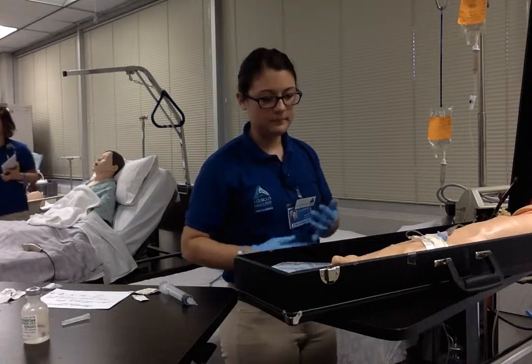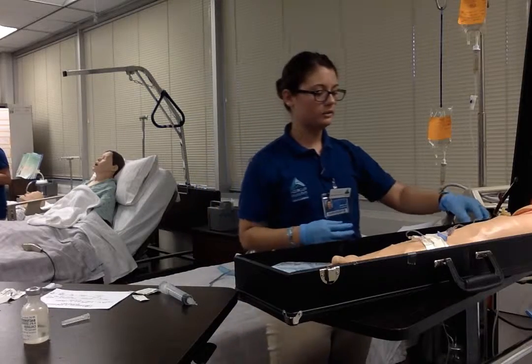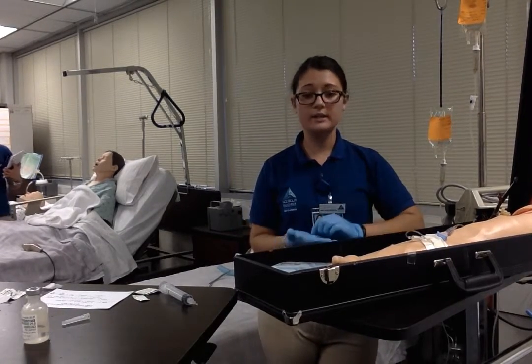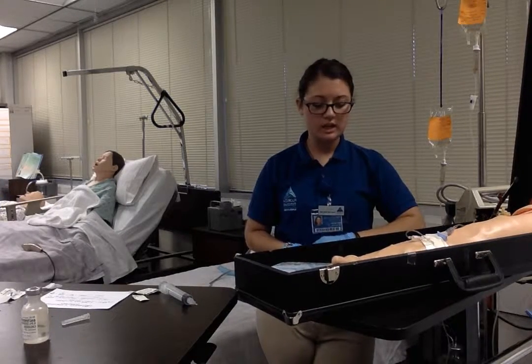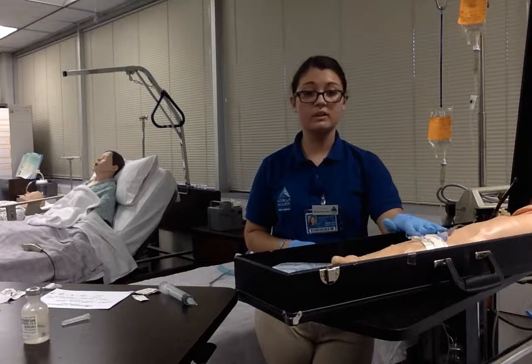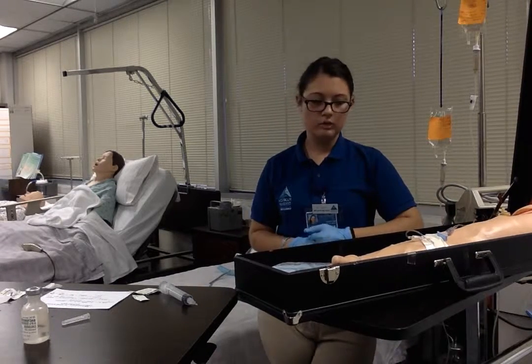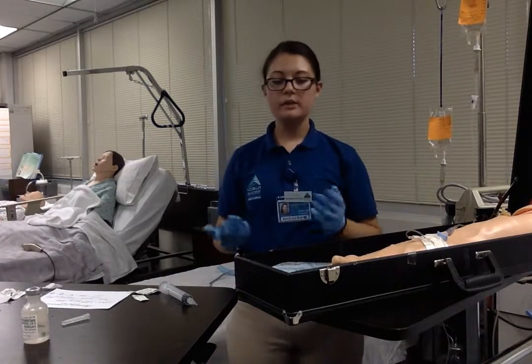All right, Mr. Jones, it looks like we have finished this part. I'm going to let you know some of the things I'm going to be documenting now are going to be the medication that I administered. I'm going to go ahead and write down my order into my MAR. I'm going to let you know the time and date that I administered it, that I have recorded the condition. Like I said, we have checked and that there was nothing going on before I gave this drug, and so we know what to look for when I come back, what was in there before. So I'm just going to go ahead and record that, again, my order and the fluid that I had given, and that'll be it for the piggyback.